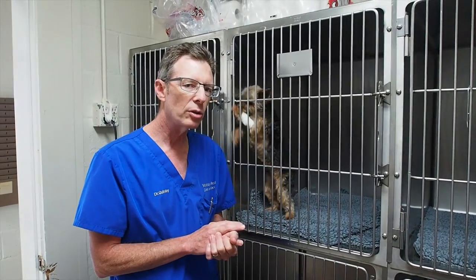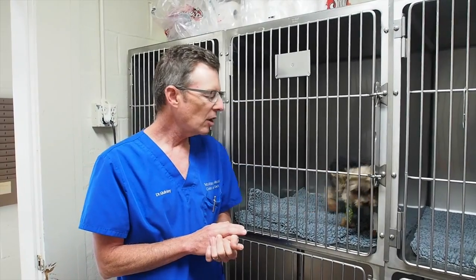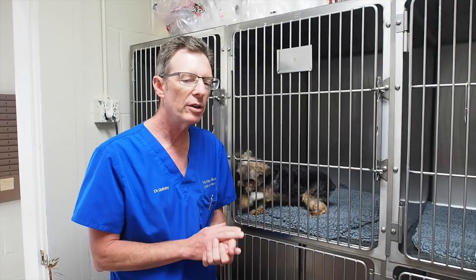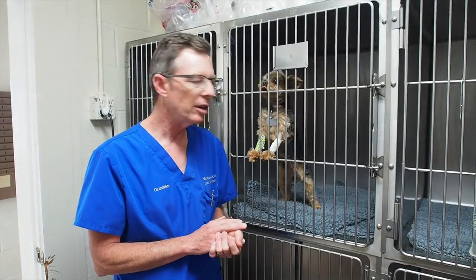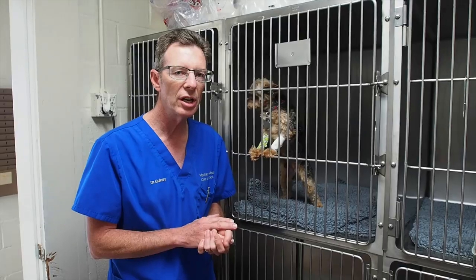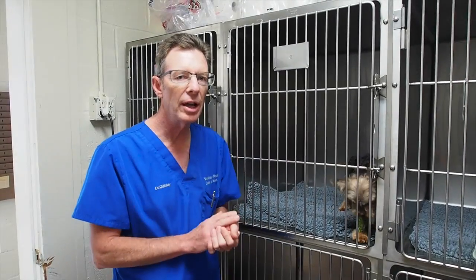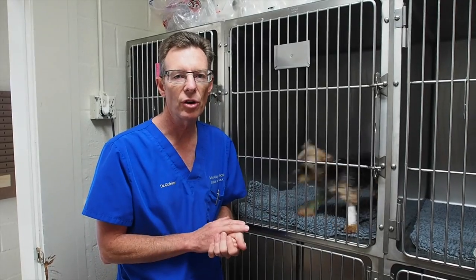So that's a short little hopefully education on how we do dentals, why we do them, why we do them under anesthetic. Most of the parts of the dental we can't do without anesthesia. If we don't take x-rays, if we don't probe, if we don't clean under the gum line, it's actually malpractice in our opinion here.